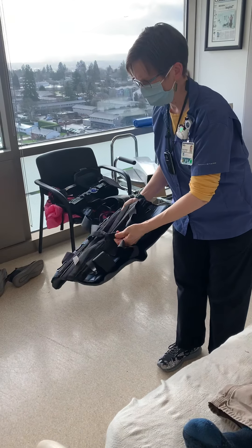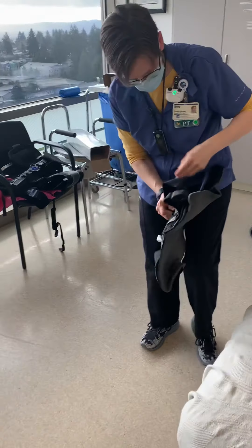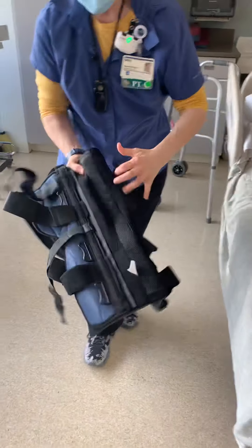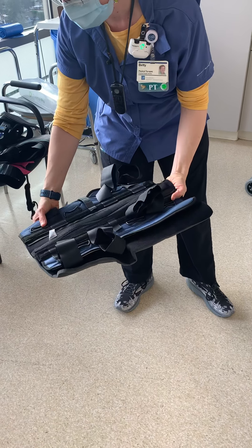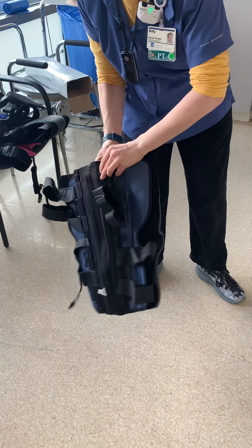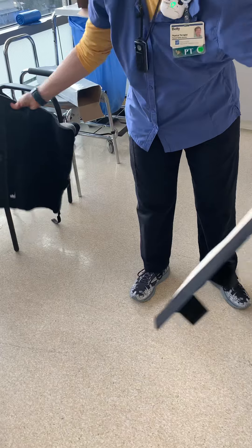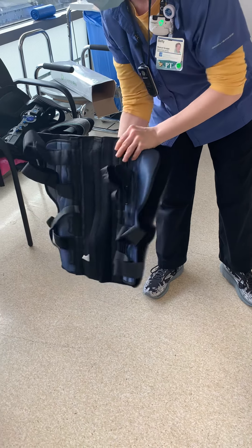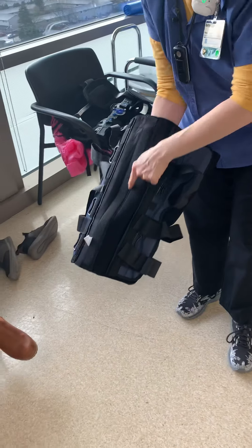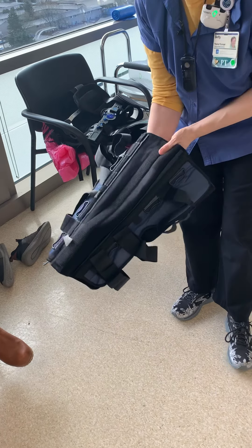So if you have to — I don't know how many of you guys have had to slap one of these on for the first time. This one's lovely, it's in great shape. Generally all these braces come slammed together in one size, but if you've got somebody that is not fitting it correctly, you can rip the whole thing off and move it out a little further away from the center upright part, because this is the part that you always want to center on the back of the leg. It's got the indentation there that goes behind the knee.